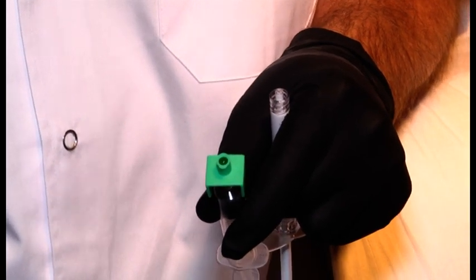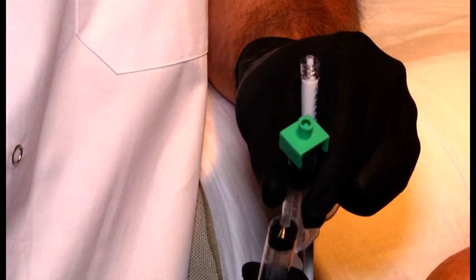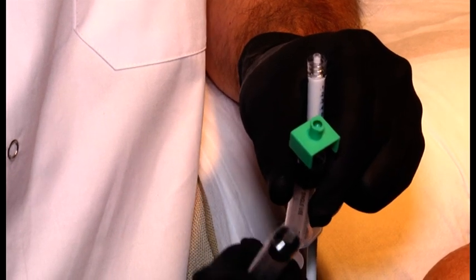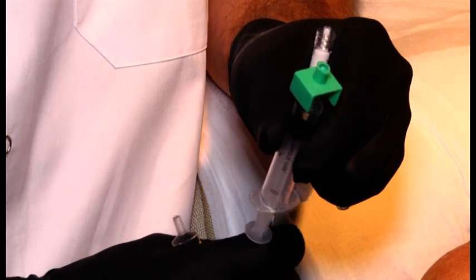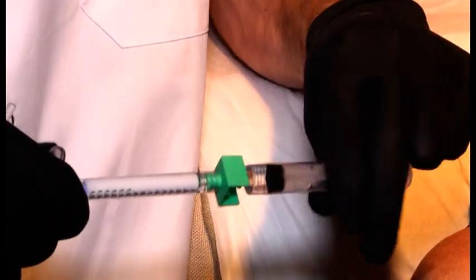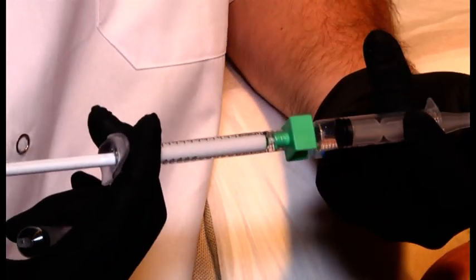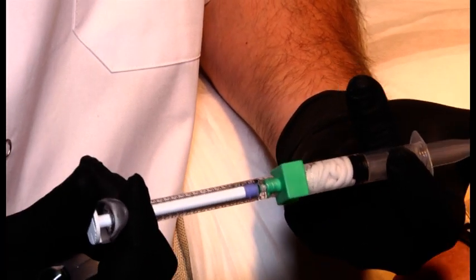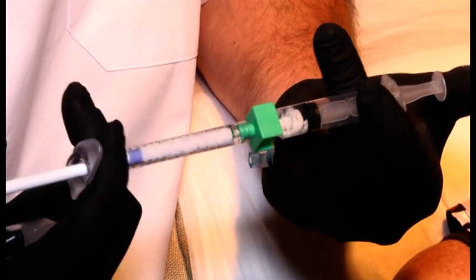All right. So the second syringe also should not contain any air. So I also take out the air of the second syringe, right? All right. Now, when I attach the Radiesse, you will see that mixing it just like this is not working, because this way it works, but that way I get to the maximum, right?